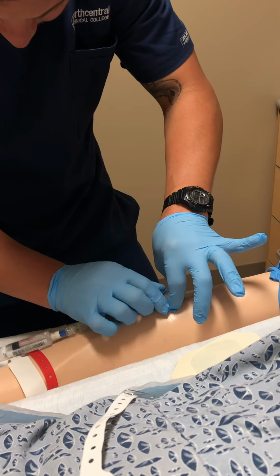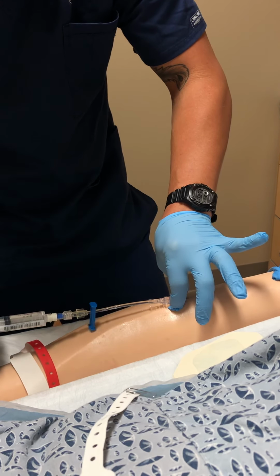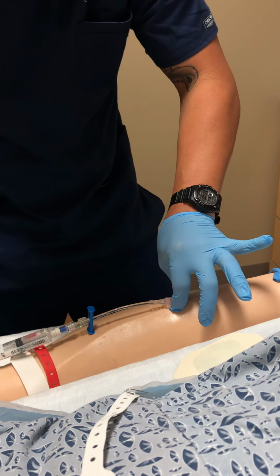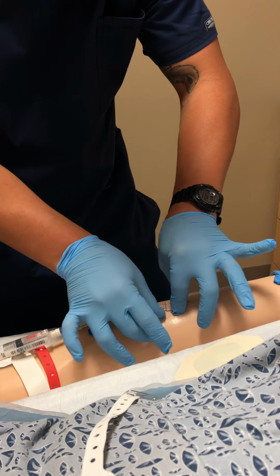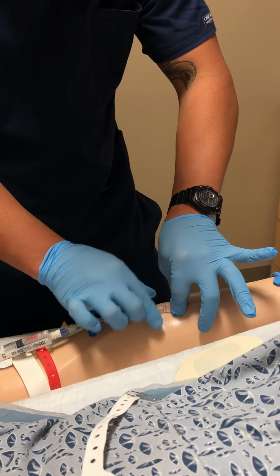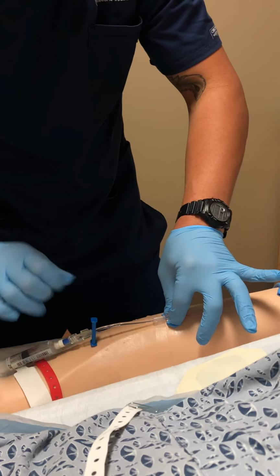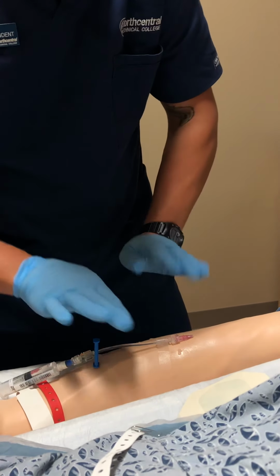Okay, everything's looking good so far. Let's just make sure that we can flush a bit here. Oh, excellent, good, we're flushing great. So I'm gonna apply a piece of tape here, tape it down, keep it in place. Everything okay, Mary? All right. So everything feels great, better than the last one that she had, she's saying. So here we got it taped down.